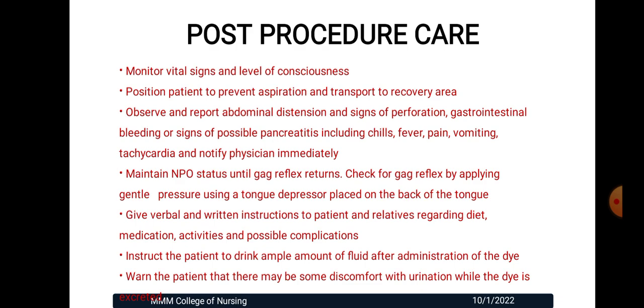Give verbal and written instructions to the patient and relatives regarding diet, medication, activities and possible complications. Instruct the patient to drink an ample amount of fluid after administration of the dye. Warn the patient that there may be some discomfort with urination while the dye is excreted.